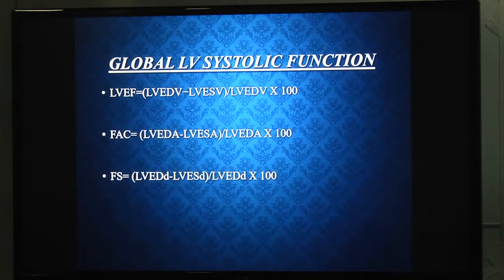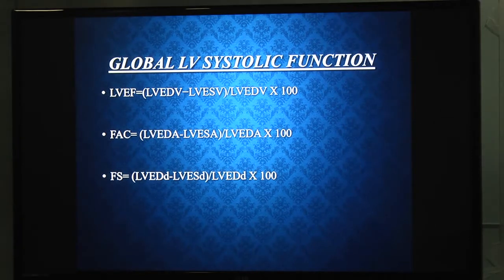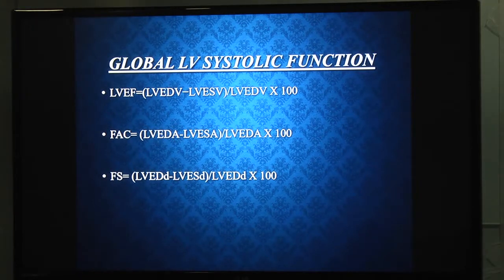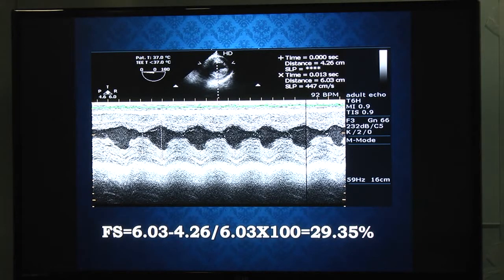For global systolic function of the LV, EF is calculated as: (diastolic volume minus systolic volume) divided by diastolic volume, multiplied by 100. Fractional area change is the LV cavity area in diastole minus systole, divided by diastolic area, multiplied by 100. Fractional shortening is: (end-diastolic diameter minus end-systolic diameter) divided by end-diastolic diameter, multiplied by 100. For fractional shortening, it is better to use M-mode in the transgastric short axis or long axis view, measuring dimensions in diastole and systole.